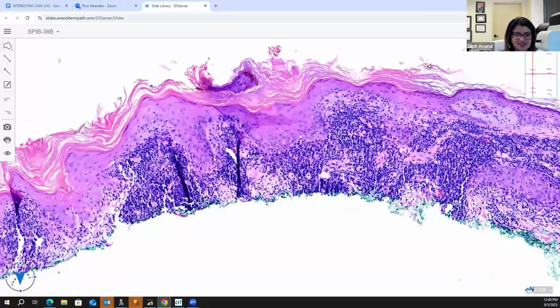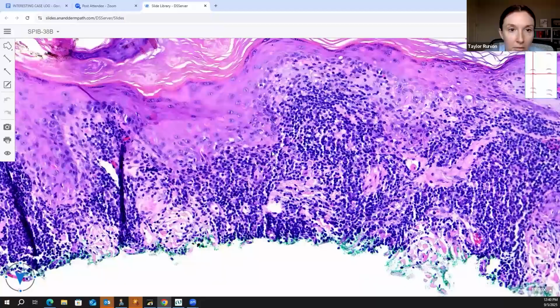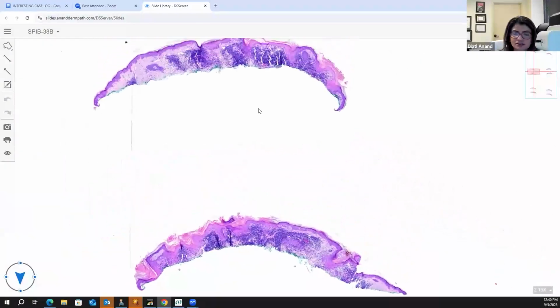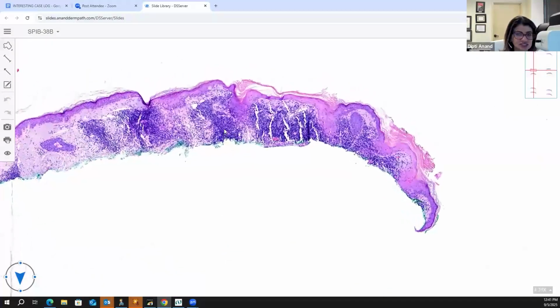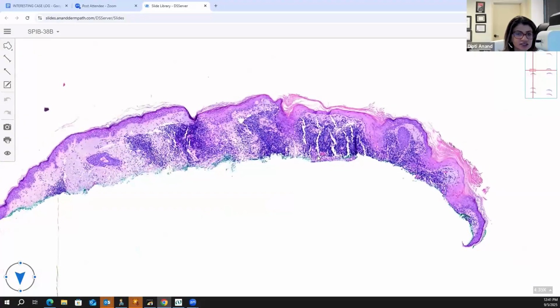So what do you think this is? For this, I was also saying discoid lupus. Yeah, so this is a very common scenario where the clinician actually didn't think that this was DLE. They biopsied it as a shave, thinking this is a tumor. And if you're not thinking right, this on a shave could easily be called AK, lichenoid AK. And I've seen that a lot of times.